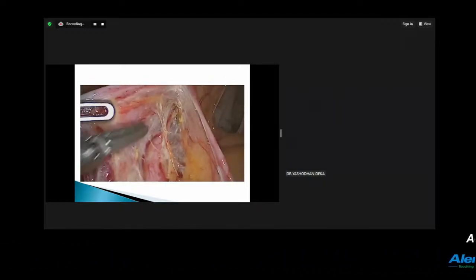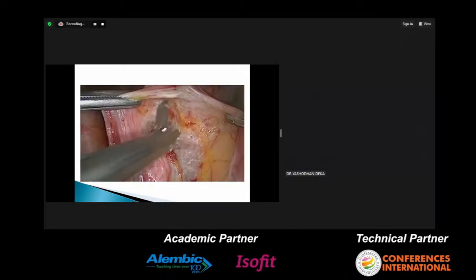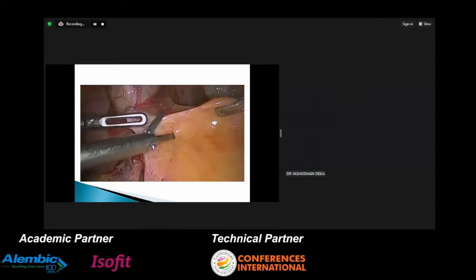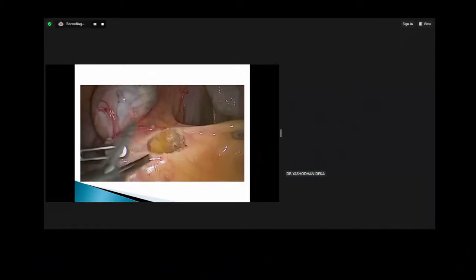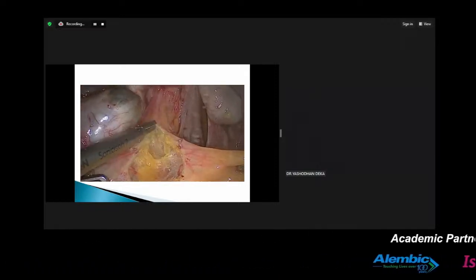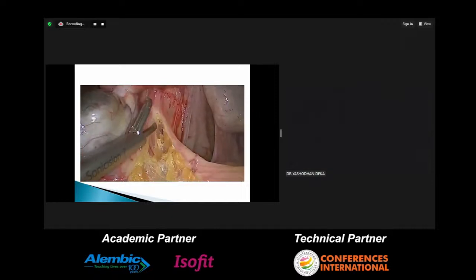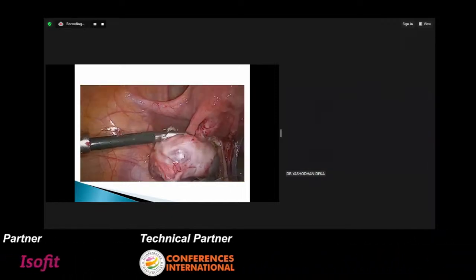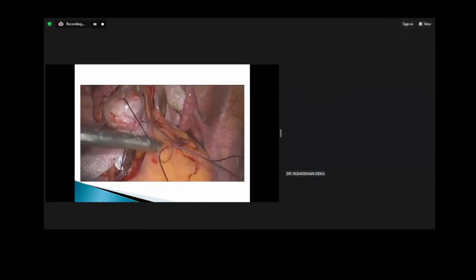So endometriosis, we all know now, is a very mathematical surgery. I call it the mathematics of endometriosis. And if you follow these steps, and we demonstrated such in Kolkata very recently, it is just a walk in the park. So you first do ureterolysis, and then you create a pararectal space. You have to understand the concept of creating this pararectal space. Then we simply suspend the ovaries.